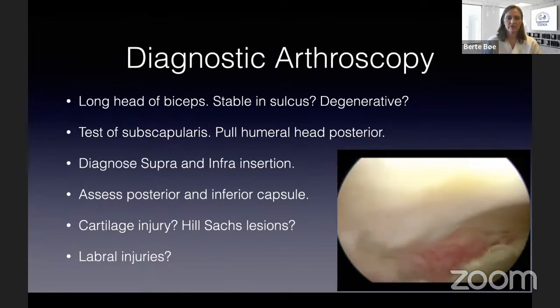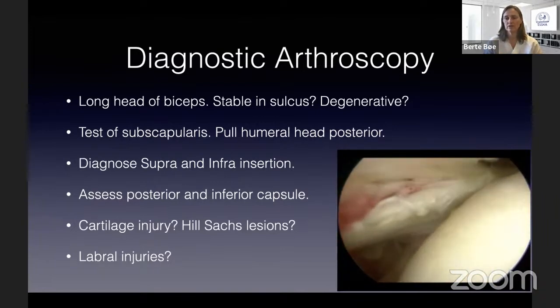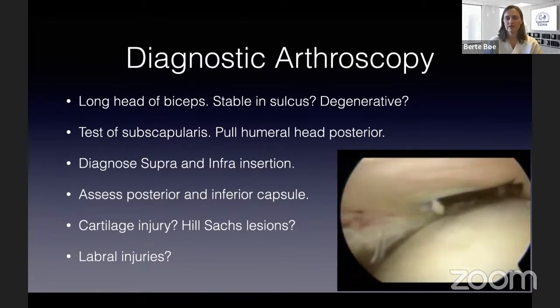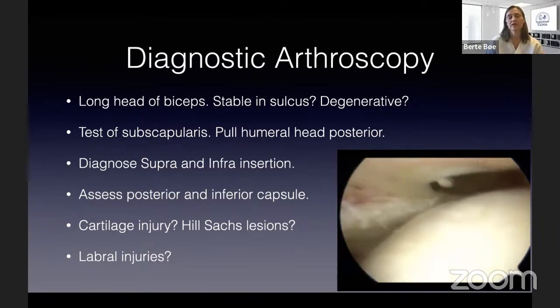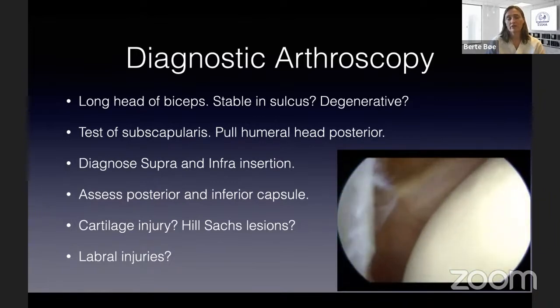And also assess the posterior and inferior capsule and look into whether they have some cartilage injury, or a Hill-Sachs lesion, because some rotator cuff tears occur after they have had a luxation. And also look for labral injuries, of course.